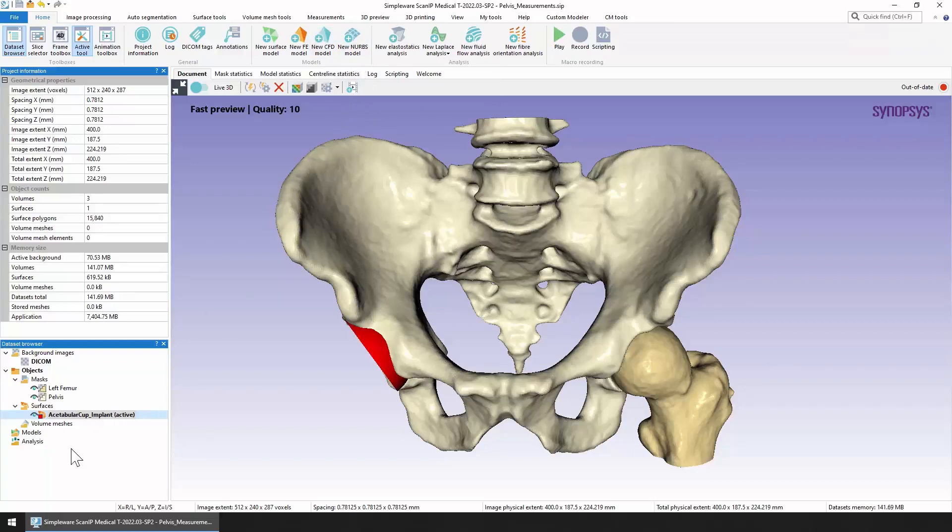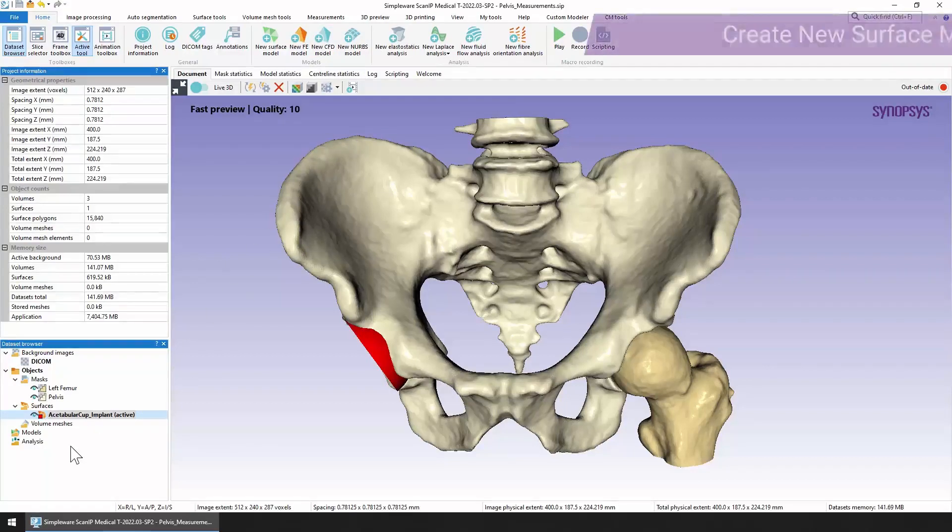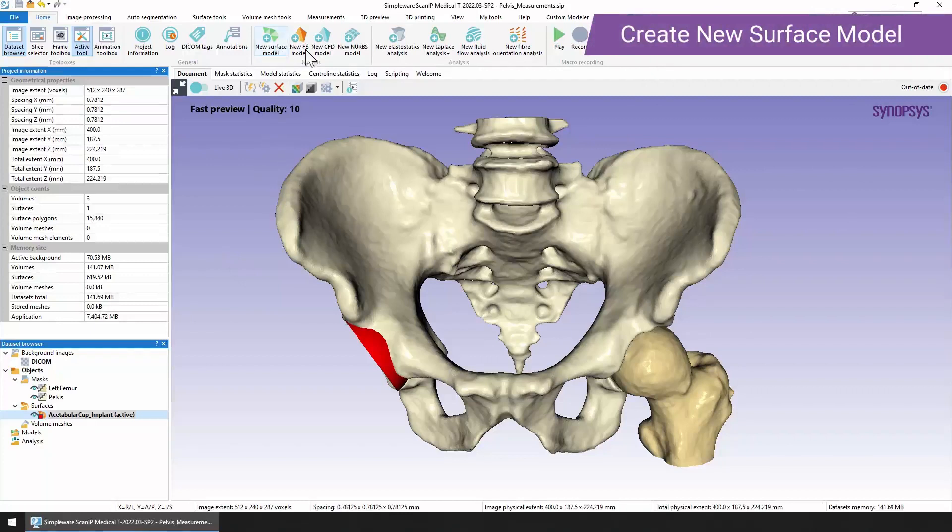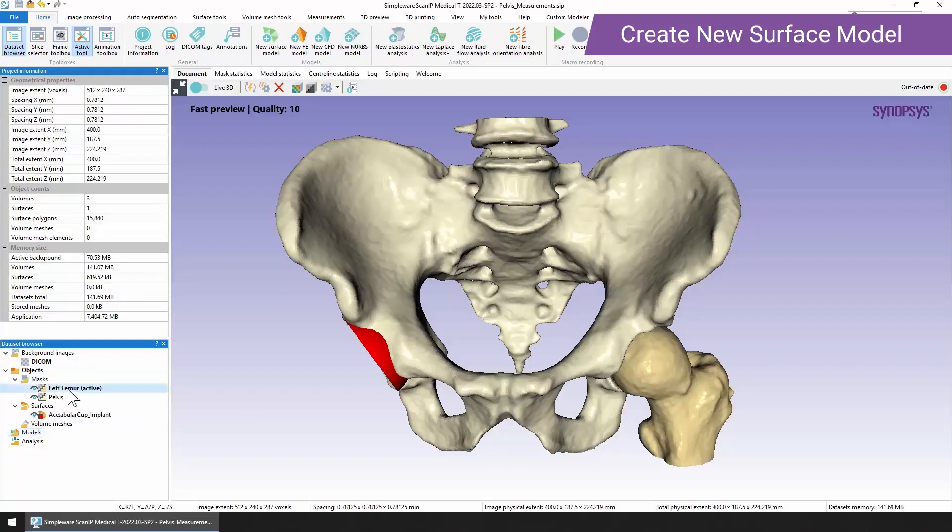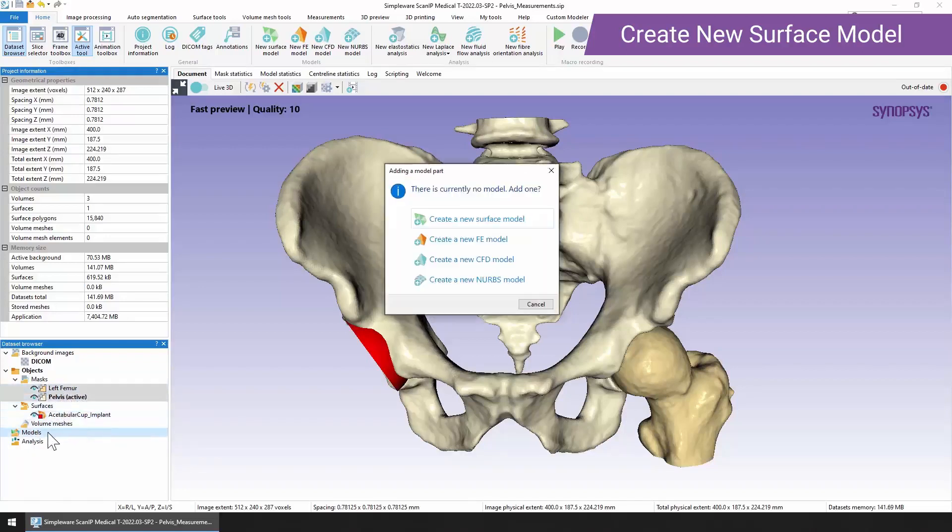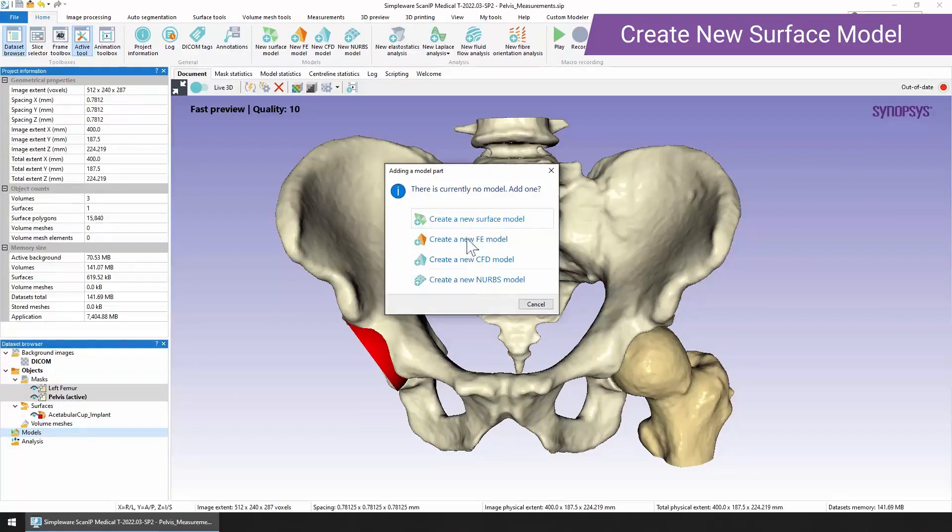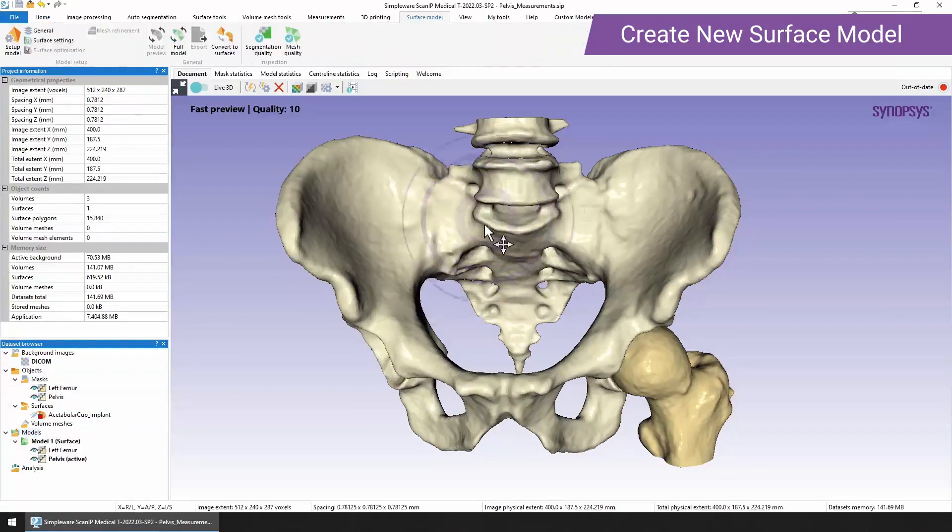In order to create one of these models we can either click on one of these buttons or we can go to the dataset browser, select the models heading, right mouse click and choose the type of model that we want to create. Or you can simply select one or more of the different parts and then drag and drop them onto the heading. We get this dialog box pop up and we can decide which kind of model we want to create. We're going to start with a new surface model.